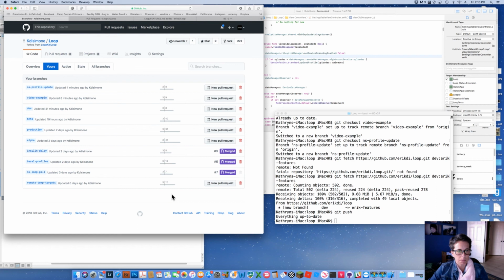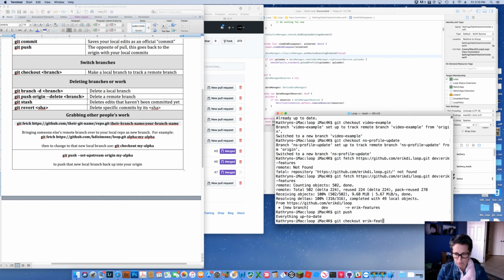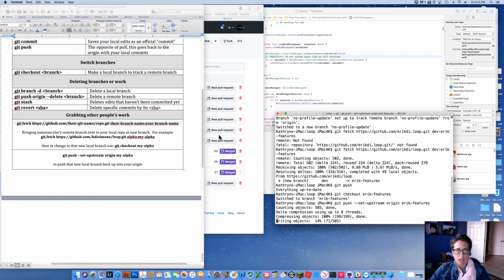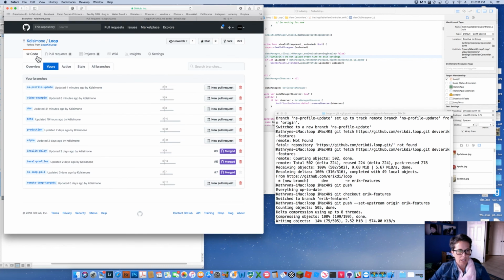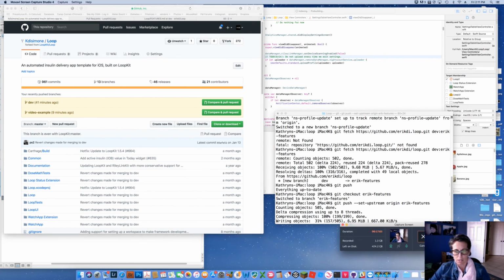I have not pushed his branch over, but if I want to, in order to get it pushed, you'll notice it's a little bit more complicated. You have to use this command. And basically, if I want to see his features, I can go to his branch and I can push it back up to my repository. And this will be pushing his branch up into my repository. As soon as it's done, I'll pause the video so that we do not have to wait.